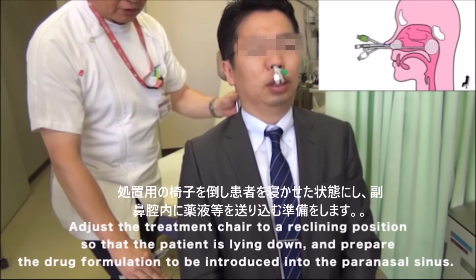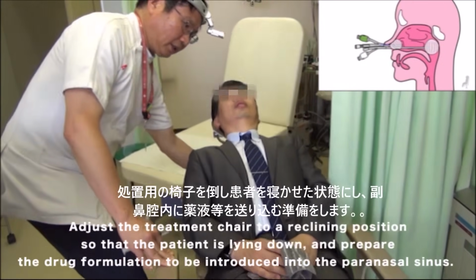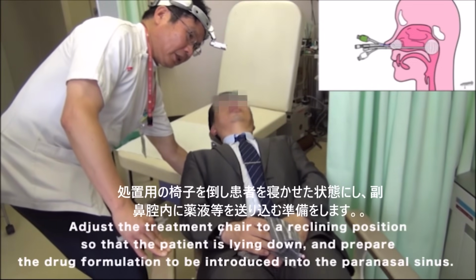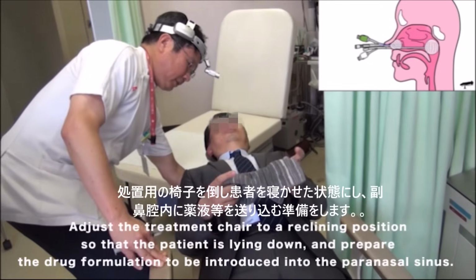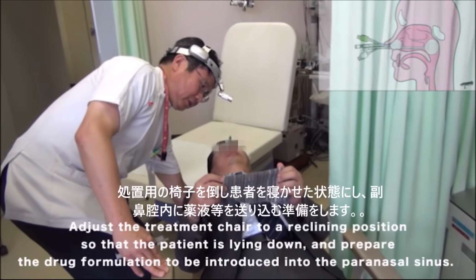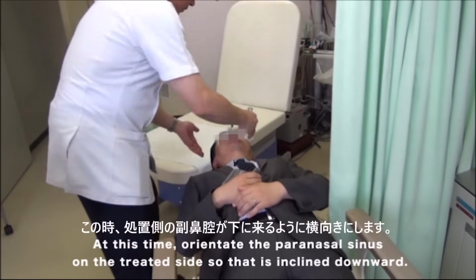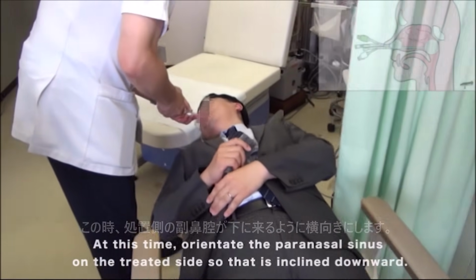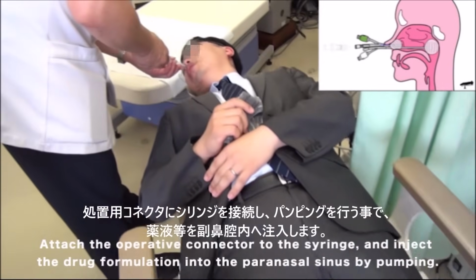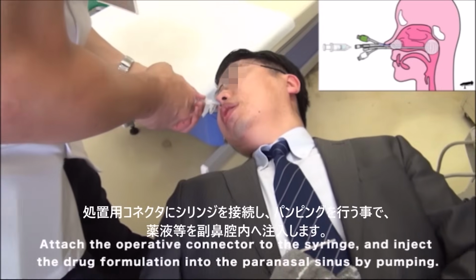Adjust the treatment chair to a reclining position so that the patient is lying down, and prepare the drug formulation to be introduced into the paranasal sinus. At this time, orient the paranasal sinus on the treated side so that it is inclined downward. Attach the operative connector to the syringe and inject the drug formulation into the paranasal sinus by pumping.